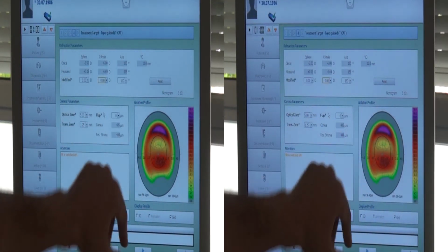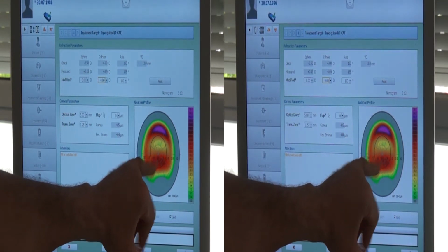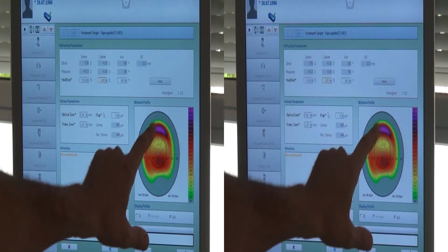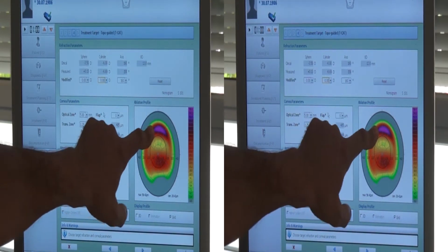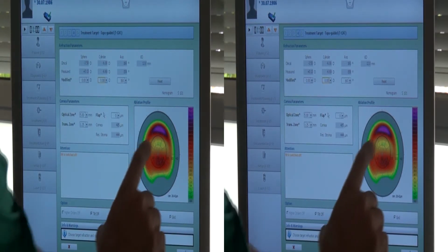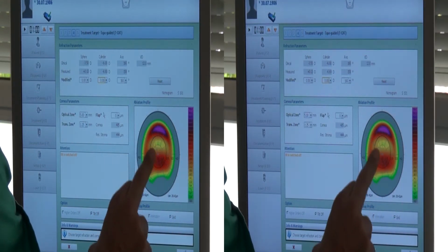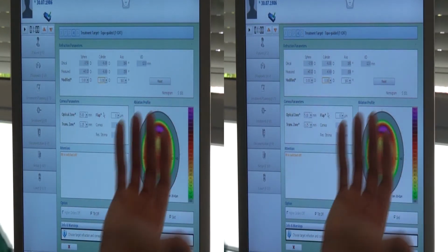So you can see what I mentioned before, that this is a partial myopic treatment over the cone, and there's a partial hyperopic treatment. This is a significant hyperopic treatment, and this is intrinsic for the proprietary Wavelight software, that it can create this hyperopic treatment in order to make this area here appear more elevated.